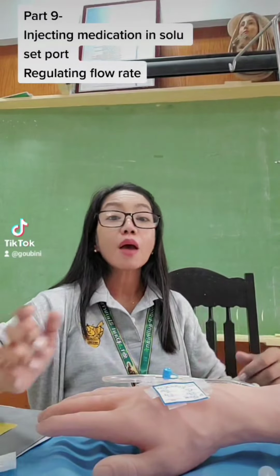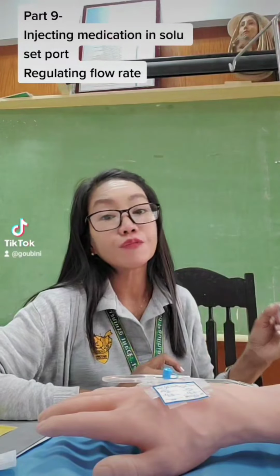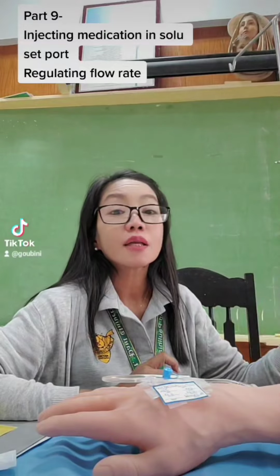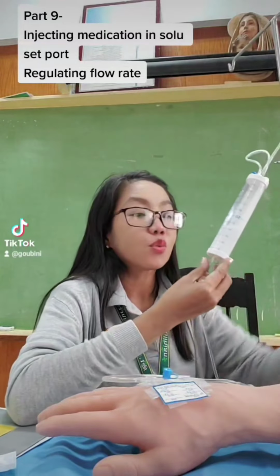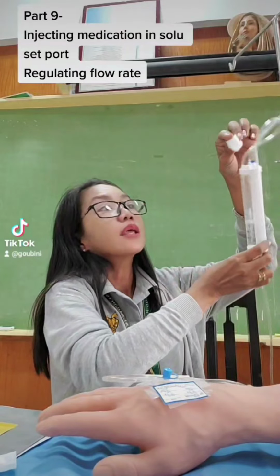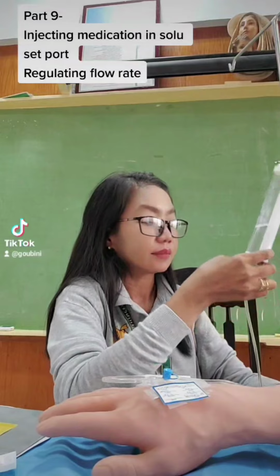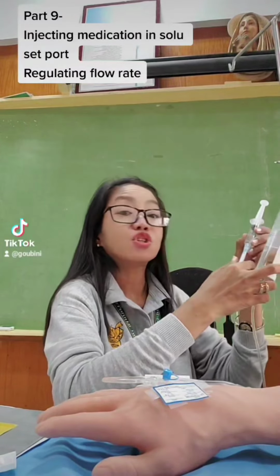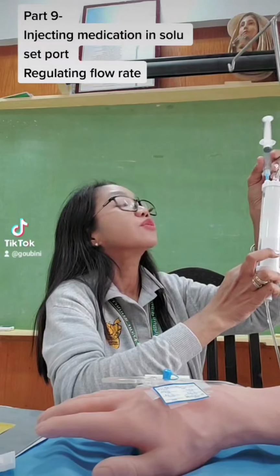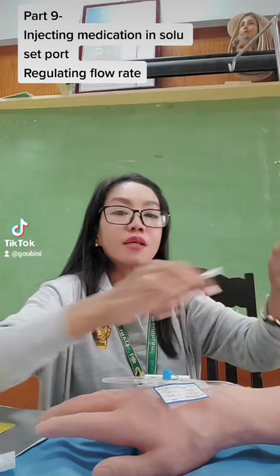We are ready now to inject the 5 cc cefepime in the soluset port. So we have to disinfect this port first, and then you will inject your medication. Make sure that the regulators are closed and not running.